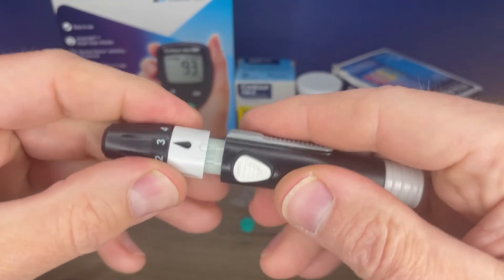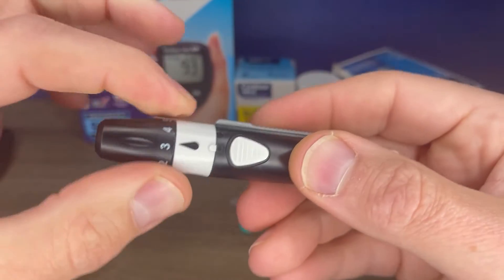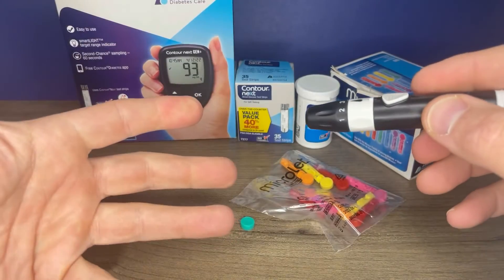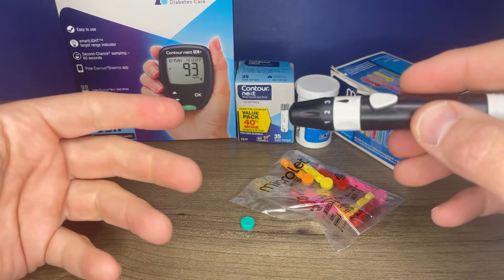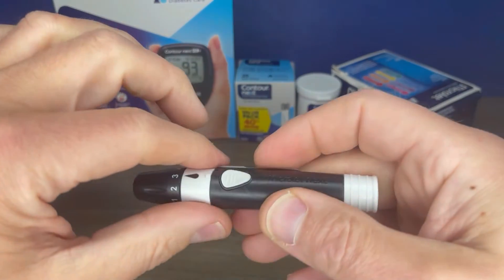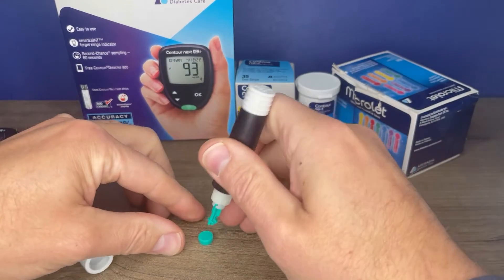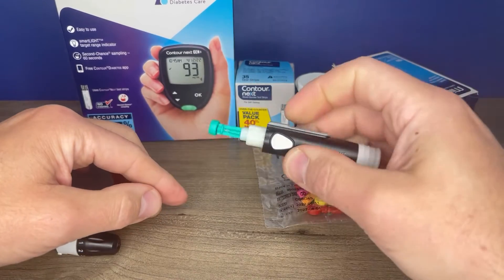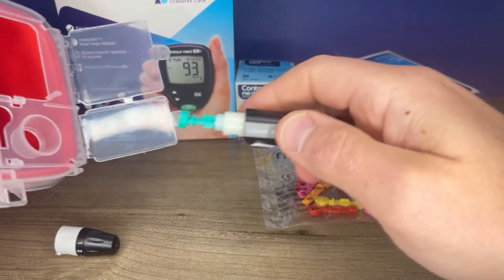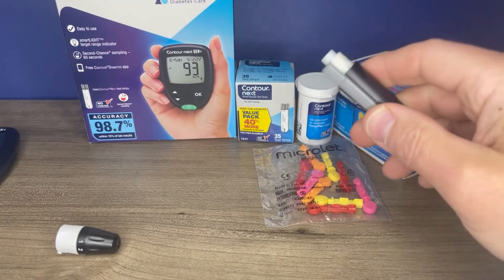Lancets are one-time use, so you want to use a fresh lancet each time. These are MicroLet lancets. Keep in mind many pharmacy store brand lancets will also work in this machine — for example, Walgreens and CVS brand lancets list MicroLet as compatible. So we have our lancet, and they recommend that you twist the top to loosen it but leave it on, then insert it into the barrel. Once fully seated, twist that top off to expose the lancet. Then you want to replace the lid — twist it to the locked position. Then you would put it against your finger and press the button. Once your reading is over, take the lancet out, jab it into the top of that piece of plastic, and you can eject it and dispose of it properly.